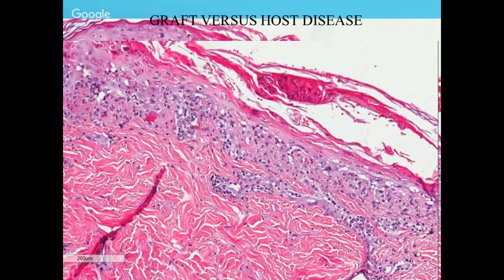In lichenoid dermatitis, we talked about a dense infiltrate at the dermal epidermal junction. In this one, there is inflammation at the dermal epidermal junction, but very, very focal and mild actually. So you're definitely always going to see some lymphocytes at the dermal epidermal junction, and especially in those vacuoles. So that is another feature that you're going to read in the book: that you see lymphocytes at the dermal epidermal junction in the vacuole actually. So you see that pattern, it makes it very easy that this is vacuolar interface dermatitis. And now what am I dealing with? You just pick up the phone and it makes your diagnosis much easier actually.